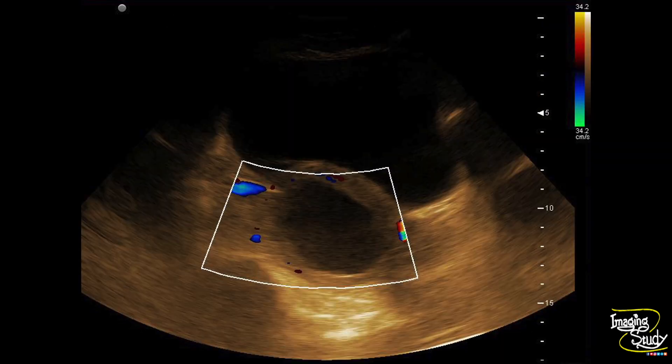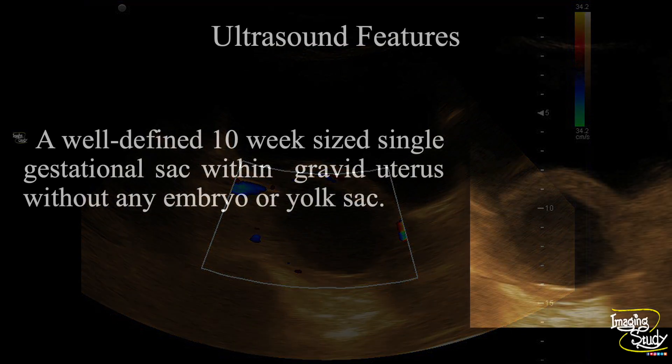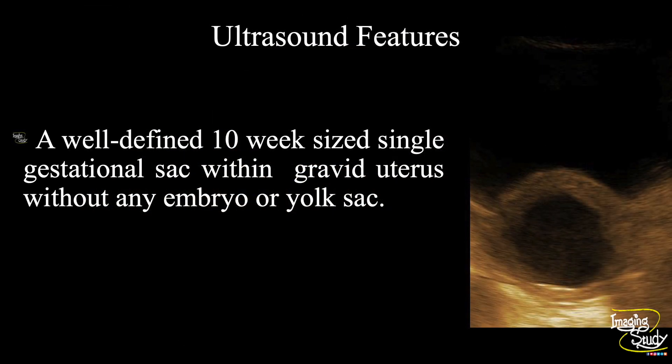This is the picture of the gestational sac without any internal embryo. In summary, a well-defined irregular 10-week sized gestational sac is noted within a gravid uterus without any embryo or yolk sac. So the diagnosis is an anembryonic pregnancy, or blighted ovum.